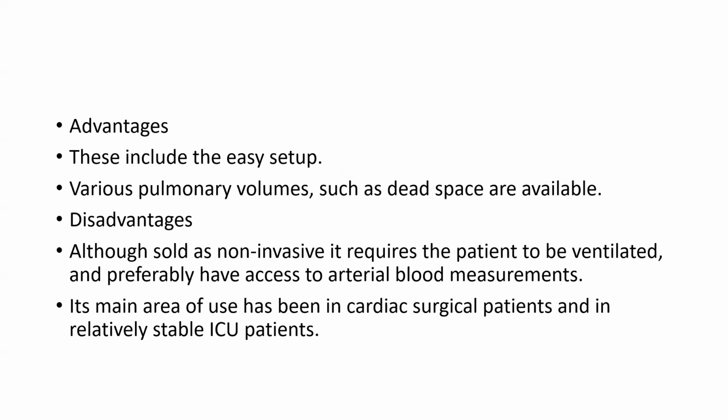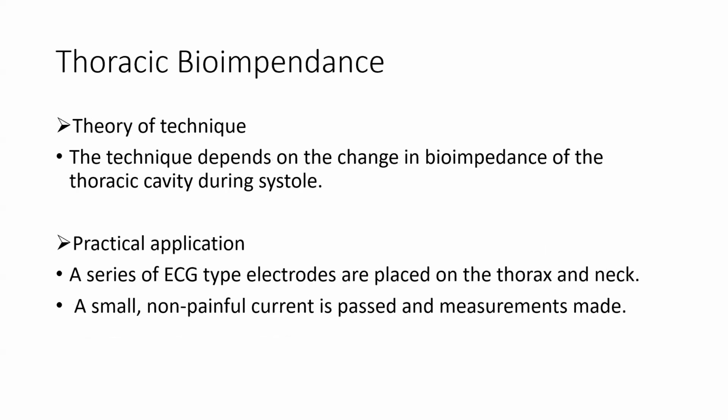Advantage: this includes easy setup. Various pulmonary volumes such as dead space are available. Disadvantage: although sold as non-invasive, it requires the patient to be ventilated and preferably have access to arterial blood measurements. Its main area of use has been cardiac surgical patients and relatively stable ICU patients.